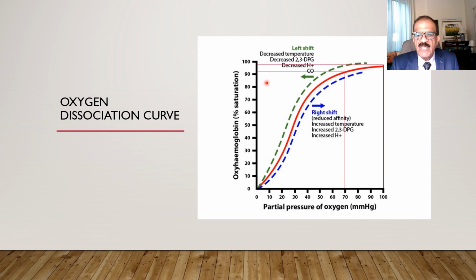So somebody with a pulse oximetry of 99 or 93, both are considered fairly well, but the actual difference is significant. Now, since we are interested in monitoring oxygen saturation in one particular patient, we use the baseline value and then we monitor it. Look at this one.